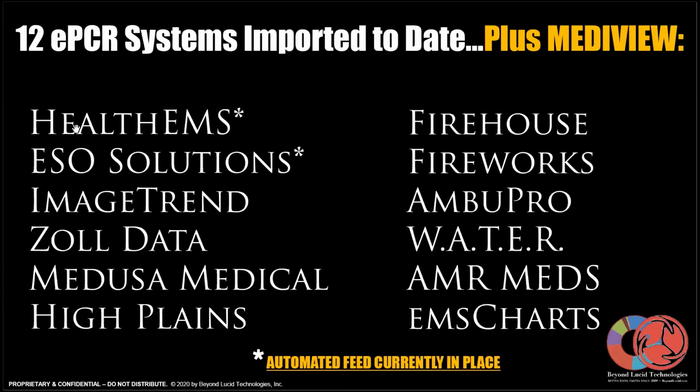system. In the intervening time, some other systems have emerged, and it's now important for us to distinguish them from the MEDIVIEW BEACON Prehospital HIE, which was the first to showcase real-time EHR consumable handoff of patient data to a hospital or other care facility.